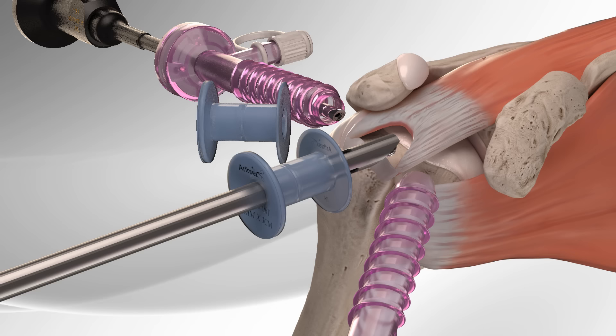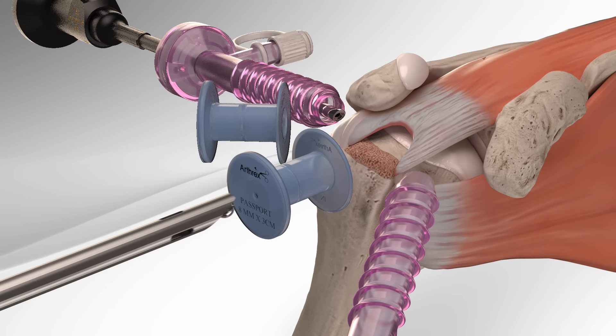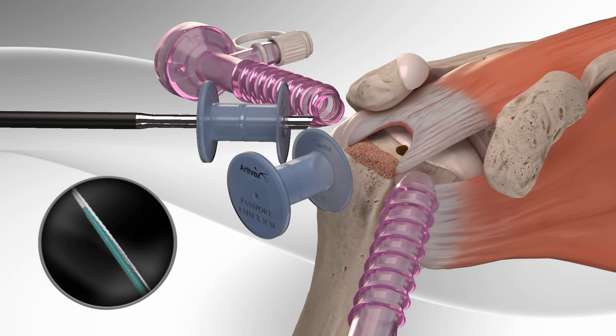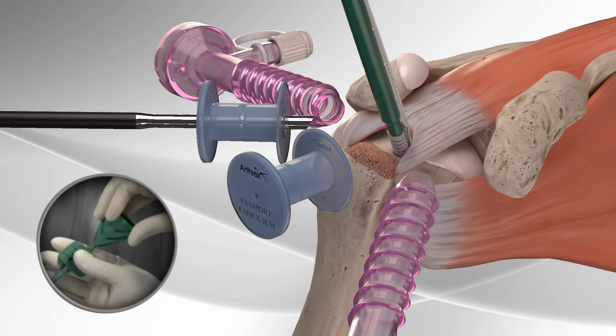First, the surgeon prepares the rotator cuff and humerus for the insertion of the first bone anchor, called a swivel lock, by punching a bone socket. The swivel lock is available with a ready-to-use fiber tape loop. The surgeon inserts the swivel lock anchor into the bone and releases the fiber tape loop.